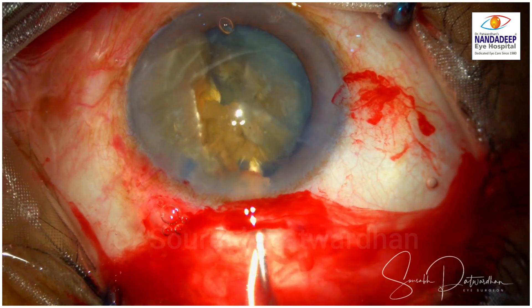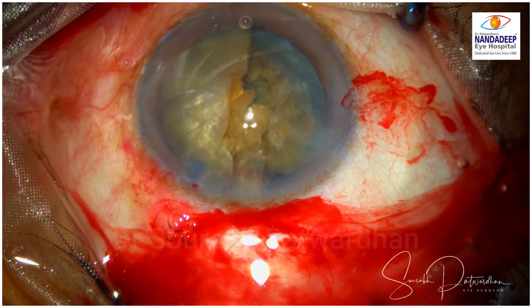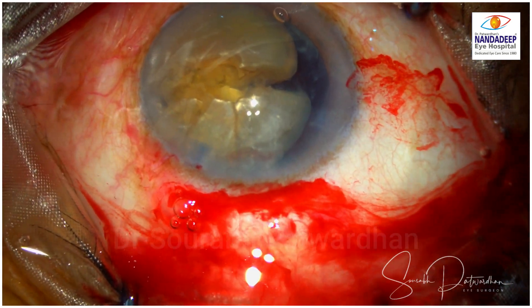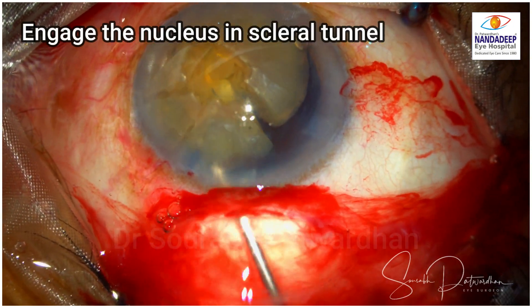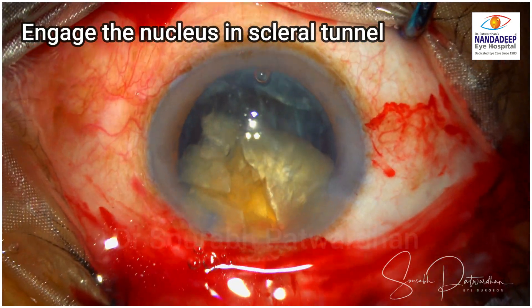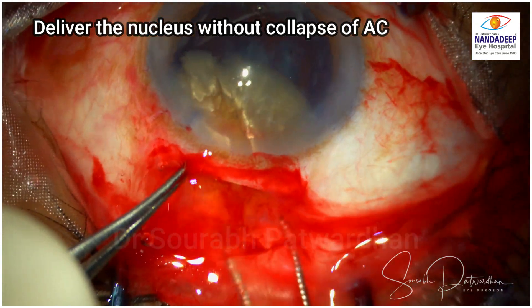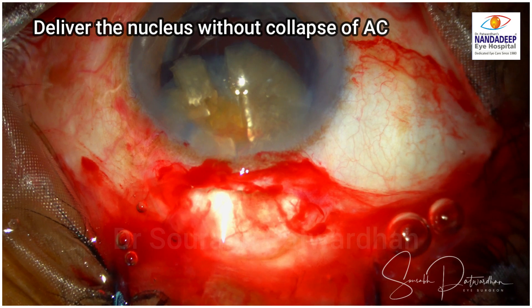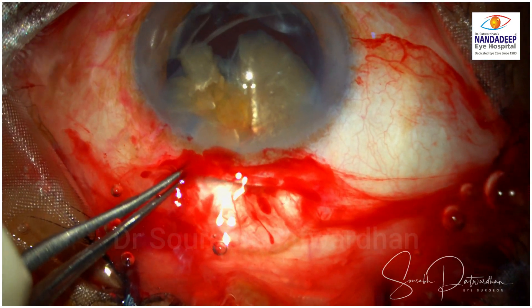I am using plenty of dispersive viscoelastic — this is 2% HPMC. Slowly, using the Sinski, I have rotated the nucleus in the anterior chamber. Now the important technique is to engage this nucleus in the scleral tunnel. Do watch my video on SICS where I show the importance of this engagement of the nucleus. The important thing here is delivering the nucleus without collapse of the AC, because we don't want vitreous prolapsing out of the incision.